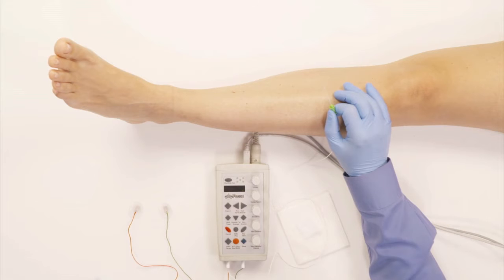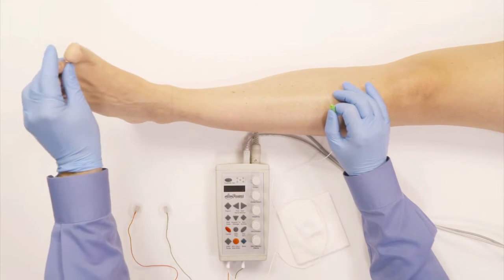Now we're going to do the extensor digitorium brevis muscle, which is a muscle innervated by the peroneal nerve and actually serves to bring your toes upwards.